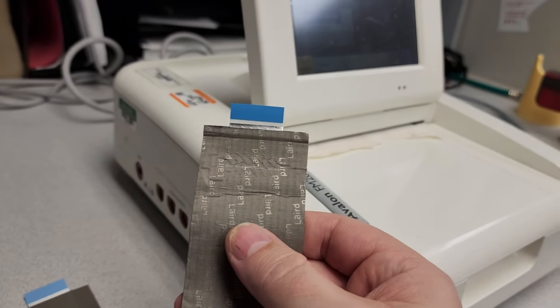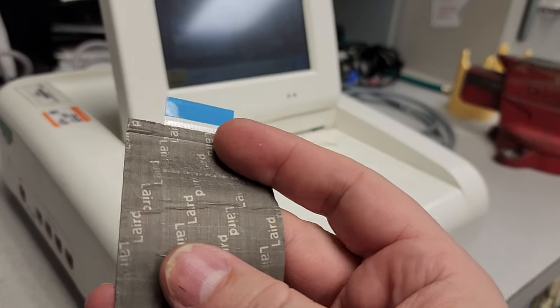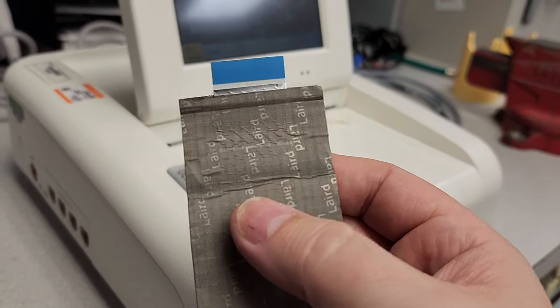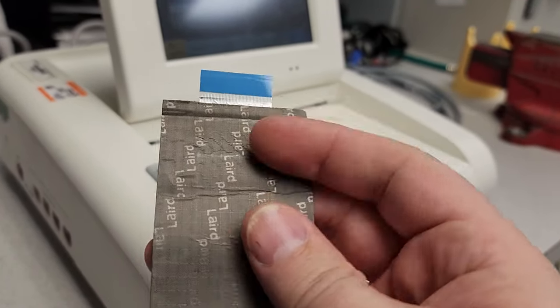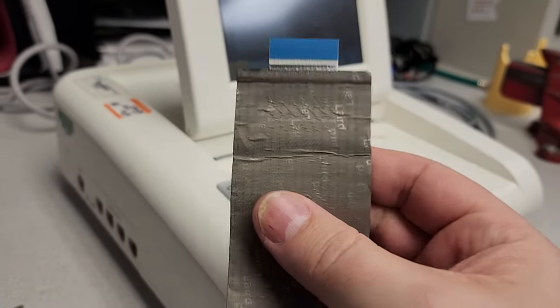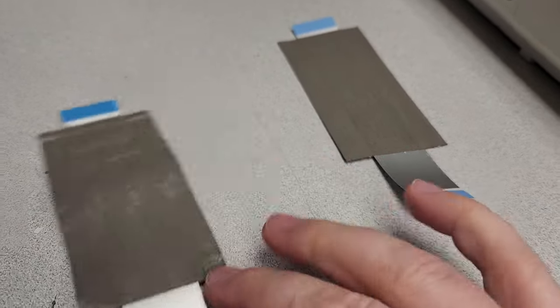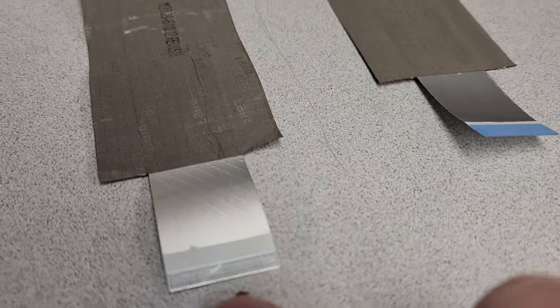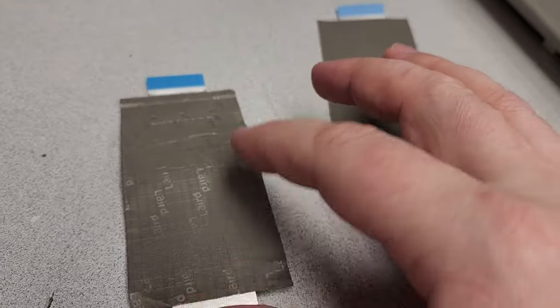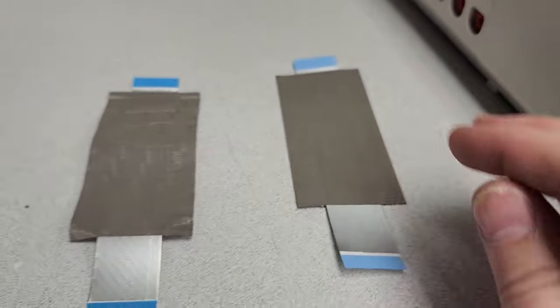Well, the shielding can be a good thing, but it hides a lot of problems. So I want you guys to take notice that whenever you have a ribbon cable and you have hard bends in it, anywhere, and you can see mine's right here. Now in reality, up close, this doesn't look that bad, it really doesn't, but when you understand all the lanes of traffic that have to go in order to make that display, those are really fine conductors going through there. So all it takes is just a couple data lines to be damaged and this guy is done.